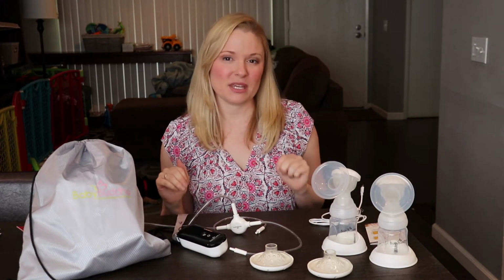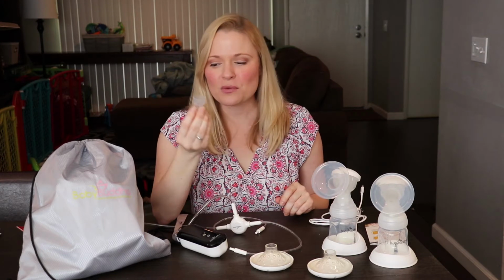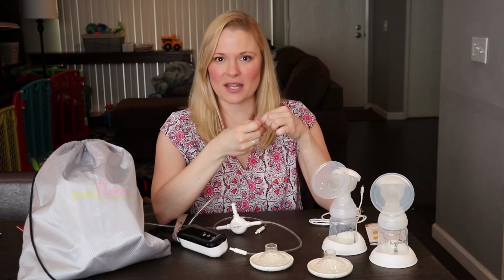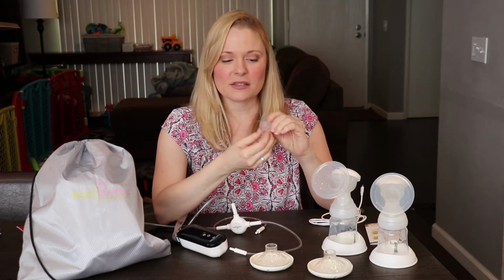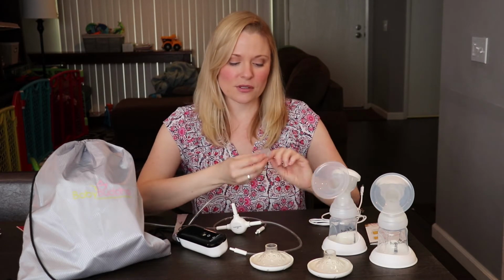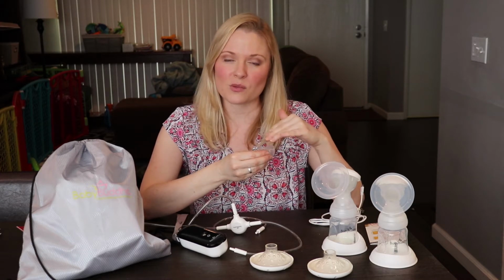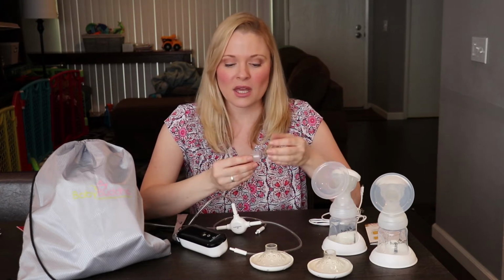Con number 2, and this is probably my biggest beef with the Baby Buddha, and it's the actual valves and the membranes on the valves. This follows a style that's similar to those Medela valves, and there's a little membrane that sits on top that has to be replaced every 6 weeks or else you lose suction.